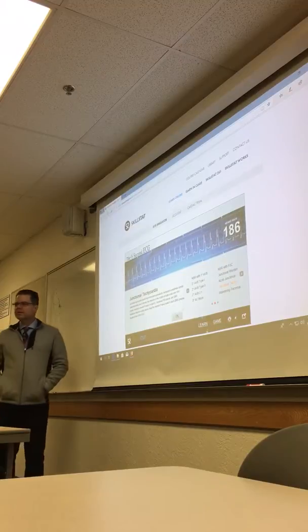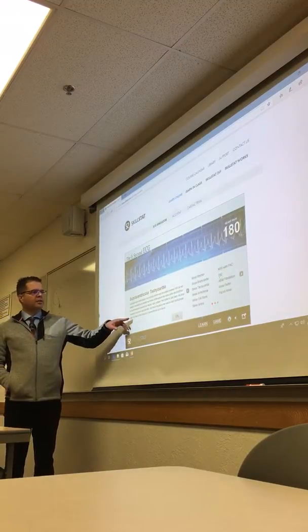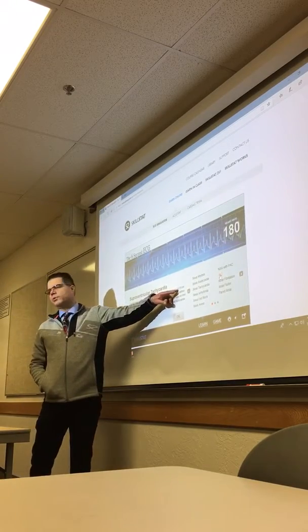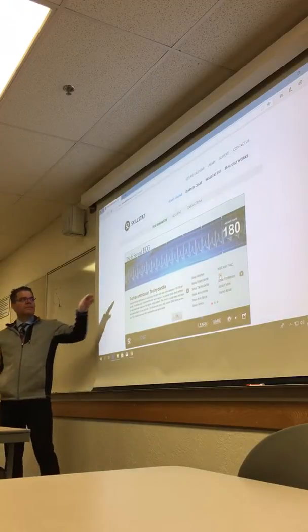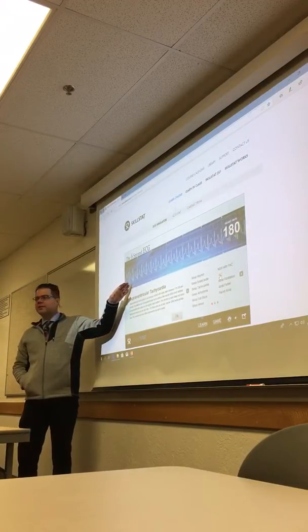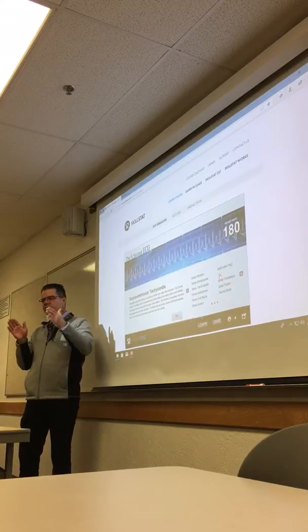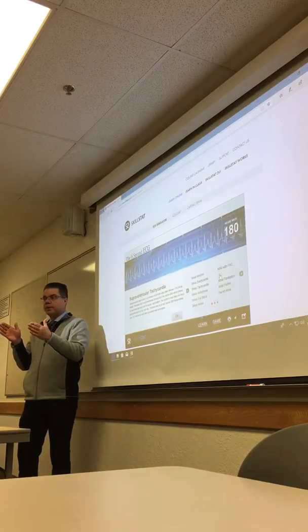Is it just a little bit slower than SVT? No, they're saying here it fluctuates between 170 and 230 in the books. But again, say that we did adenosine and stopped the heart and then it was slow again and then it sped up again, that's when the cardiologist would look at the underlying rhythm and say, yeah, there's definitely no P waves in here.